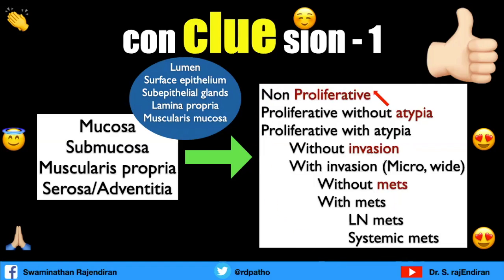All non-proliferative lesions, treatment is the same. All proliferative atypical lesions without invasion, treatment is the same. That's why this pattern analysis is very, very important.